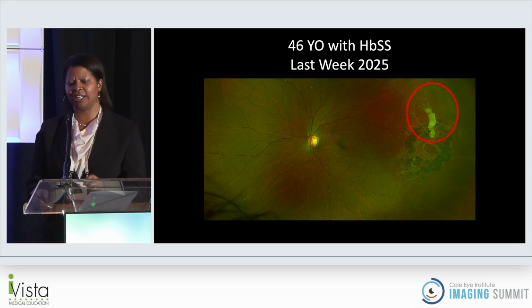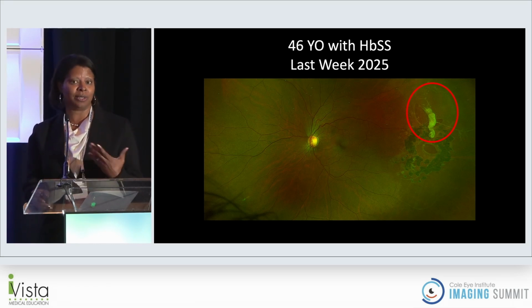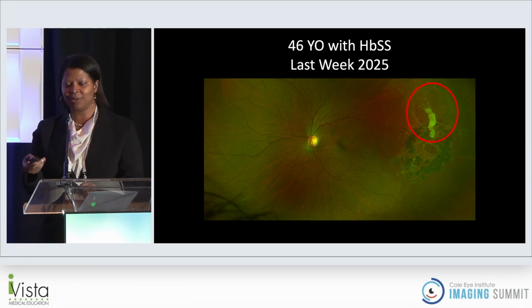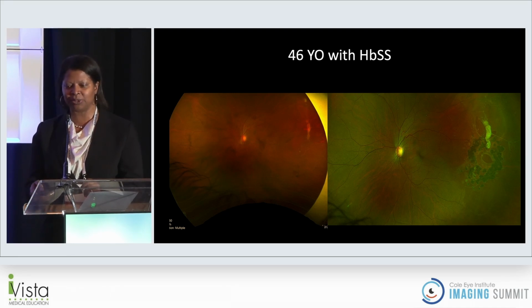He already had one tear, and then he kind of spontaneously, asymptomatically came up with another tear. So this is somebody I need to follow closely. And actually, his other eye was the eye of interest. So you can see the comparison just over time, just following on the wide field imaging really helped to understand what the pathology was looking like over time. And there's a cuff of subretinal fluid around the peripheral tear, and we did laser that.